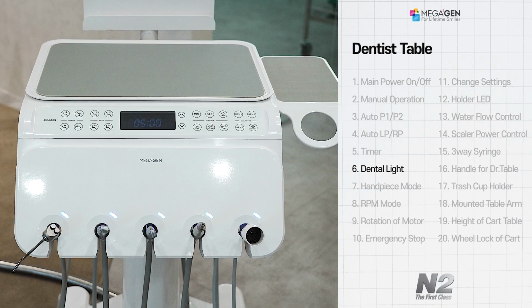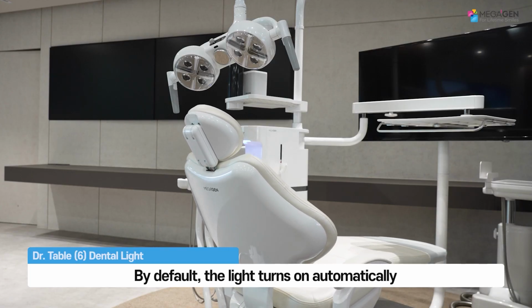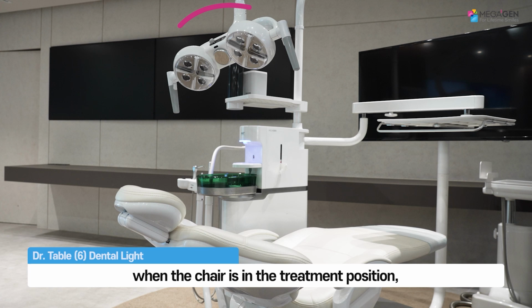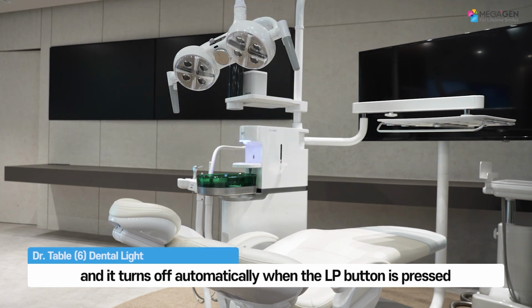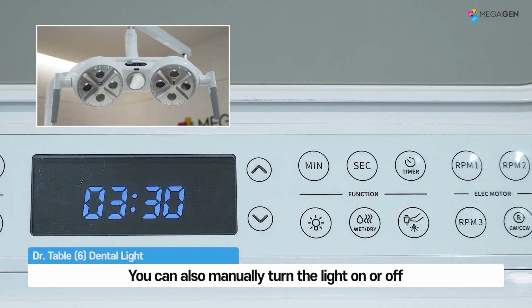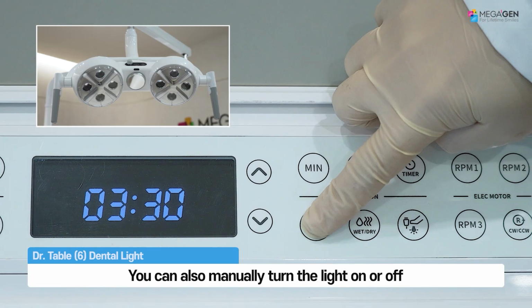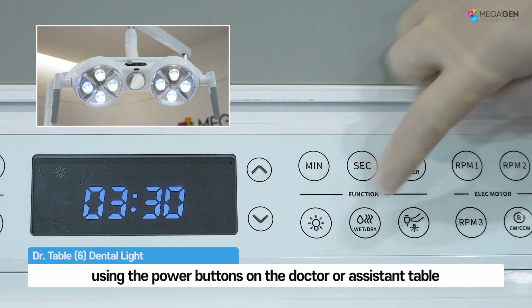Light main power. By default, the light turns on automatically when the chair is in the treatment position, and it turns off automatically when the LP button is pressed. You can also manually turn the light on or off using the power buttons on the doctor or assistant table.